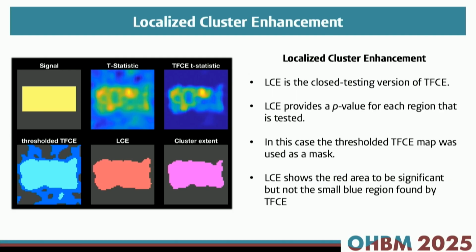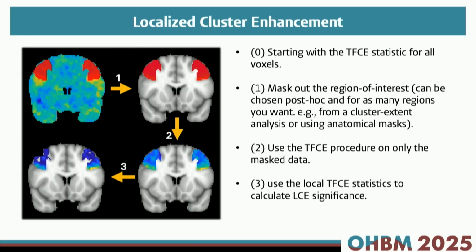You can do it after your TFCE analysis to give you some extra information on whether the clusters that you find are actually significant. And the nice thing about this is that you can use it on any cluster that you have in the data, also any cluster that you define afterwards. You can get TFCE or LCE significant statements on it, and I'll show you an example in a bit.